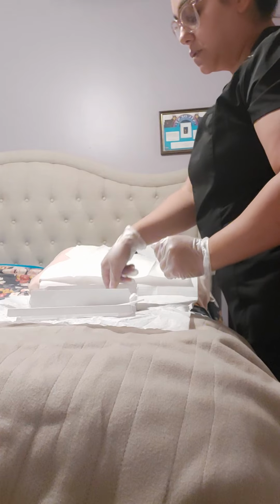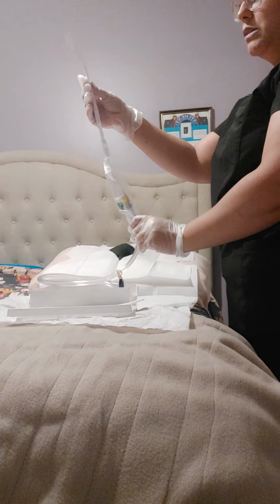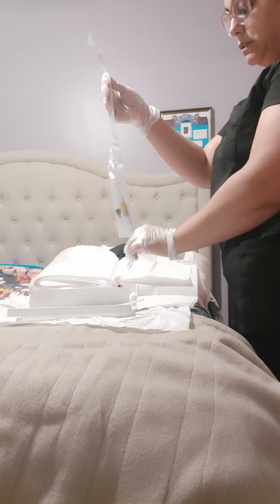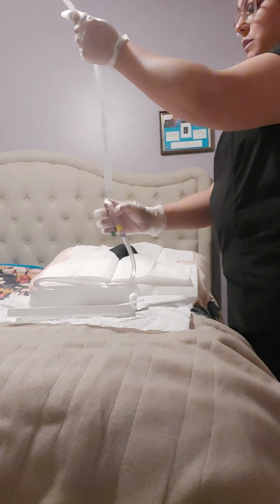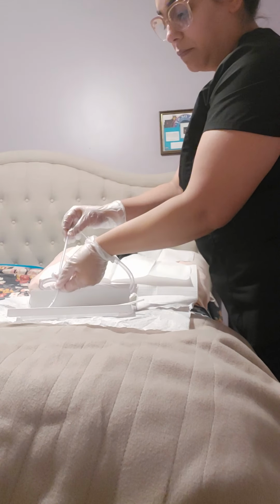Then I would like to prepare my catheter. And you need to be very careful because the catheter tip is sterile. So I just pull it out, throwing this away, and I just put it into my jelly.